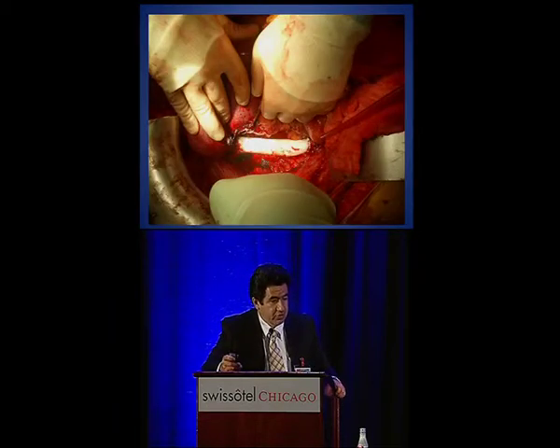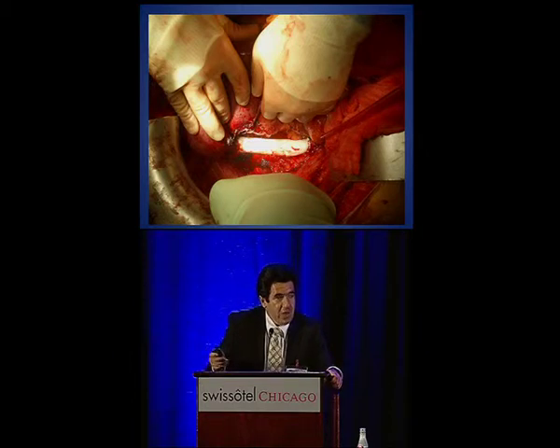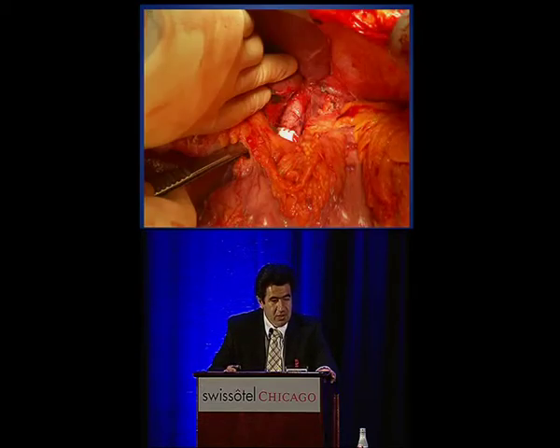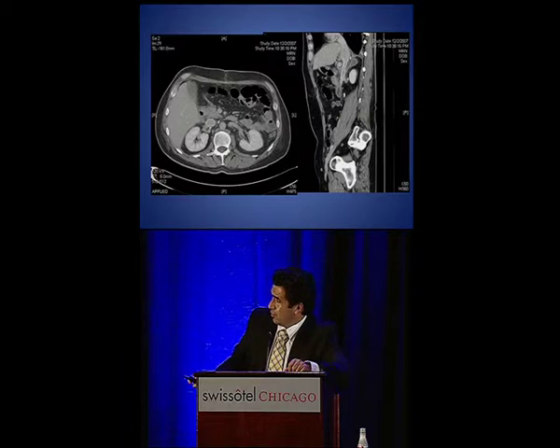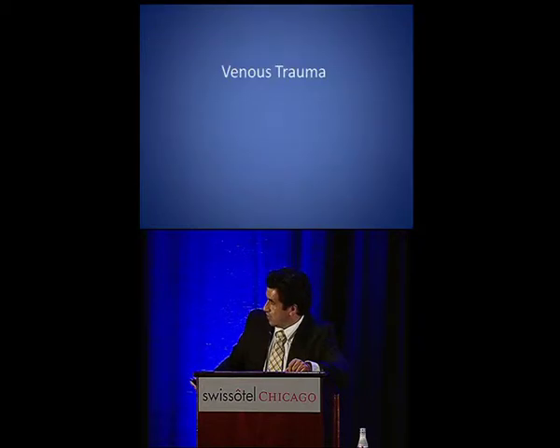The vena cava is another vessel that we have repaired on occasion. That poses another issue. You don't have a conduit large enough, and so PTFE grafts are a good option. More often than not, you should use externally reinforced grafts. This is an example of a vena cava that was repaired. The outflow anastomosis is behind the liver, and the patient, for other reasons, had a CAT scan a few weeks later. You can see the patent cava. And the outflow anastomosis is really high behind the liver. This could be very challenging. You need to mobilize the liver extensively in order to be able to reach all the way up there.